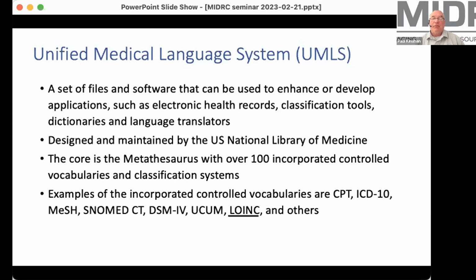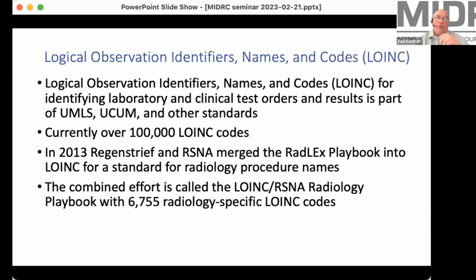And I should mention, for those of you familiar with SNOMED CT, an agreement was reached between SNOMED CT and LOINC to start looking at establishing correspondence between SNOMED CT and LOINC codes, which will be something to look forward to. I think it's early days in that effort. So just to establish the credibility of LOINC and its sustainable nature, it's been in operation for some time, as I mentioned.